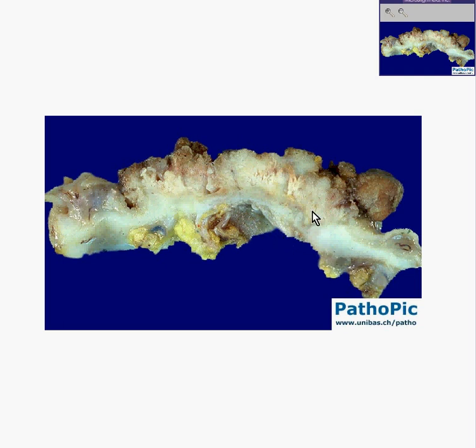The serosa and fat are out here. All of the stuff here on top, on the north, is mucosa. Note that we have a uniform rim of mucosa here. We have an abundant amount of soft, yellowish, fatty, vascular submucosa. We have a good amount of uniform wall, or the muscular layer. And then we have looser connective tissue and fat.